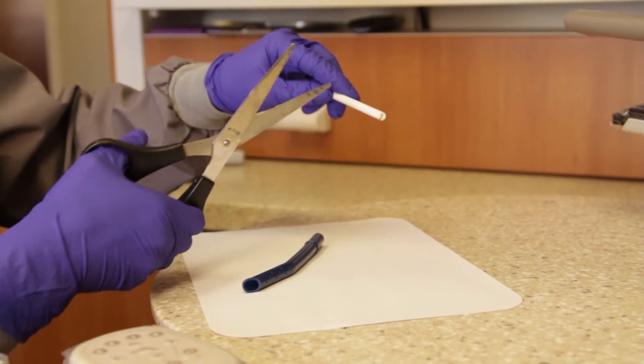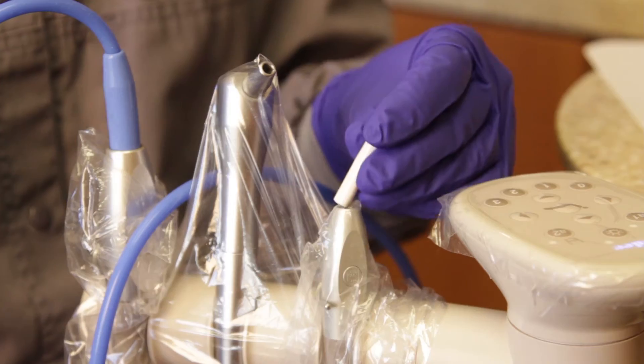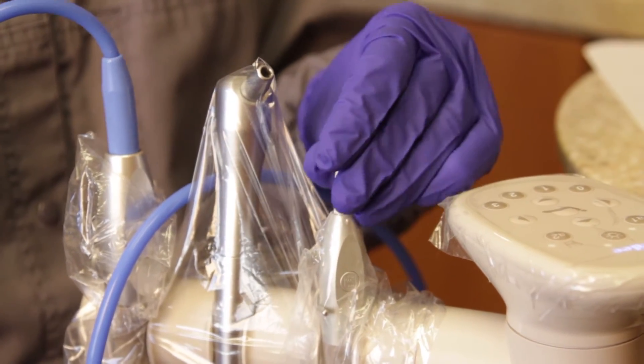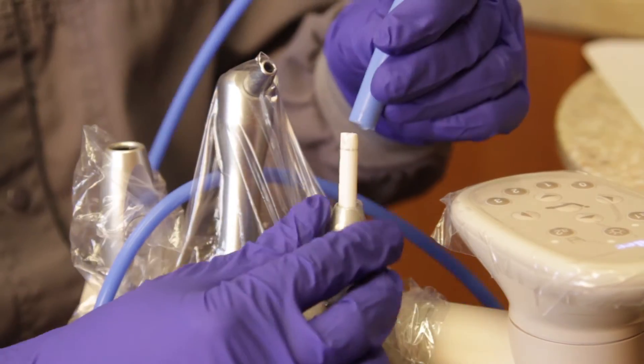To make the BlueBoa adapt to the low volume suction, cut a quarter inch saliva ejector into small pieces. Moving the tubing over also provides adequate isolation without drying the patient out to an uncomfortable level.